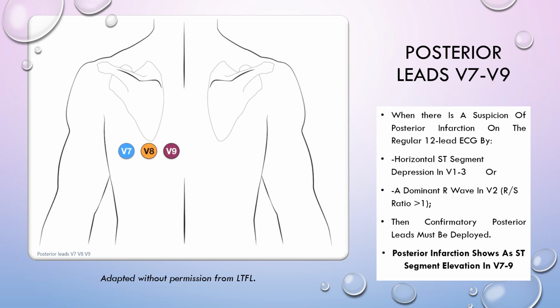Now let's go to what we know as posterior leads, V7 to V9.